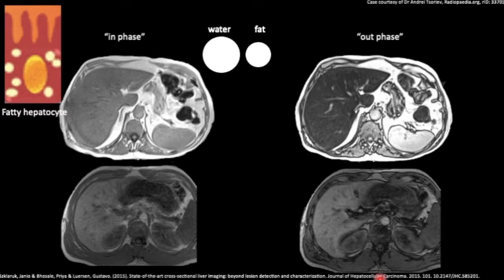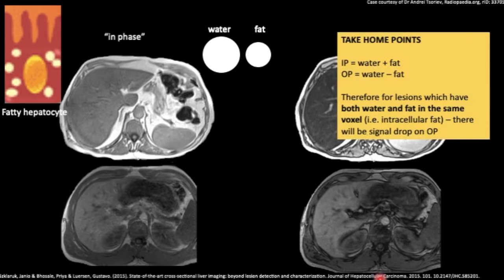Our take-home points are in-phase is water plus fat, while out-of-phase is water minus fat. For lesions with intracellular fat, such as fatty liver or adrenal adenoma, there will be signal drop on out-of-phase. To distinguish which one is the out-phase image, look for the artifactual dark signal lining the organs here. This is called the India ink artifact.